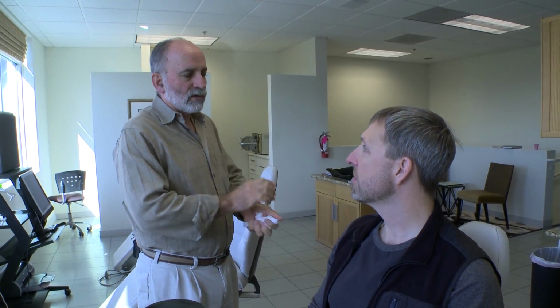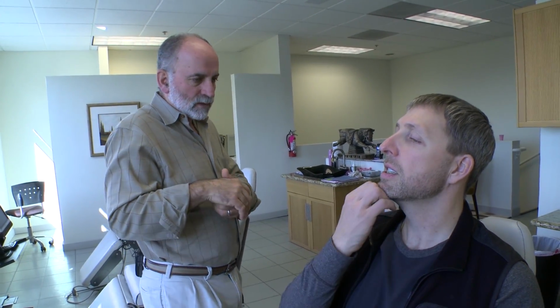The appliance that we use for nighttime is what a lot of dentists would call a neutral bionator. We call it a nocturnal orthopedic positioner. But it basically fits both jaws simultaneously. Both the upper teeth and lower teeth fit into it on what we think is ideal trajectory. And so it doesn't let the jaw fall back at nighttime. It keeps the lower chin in the same position.